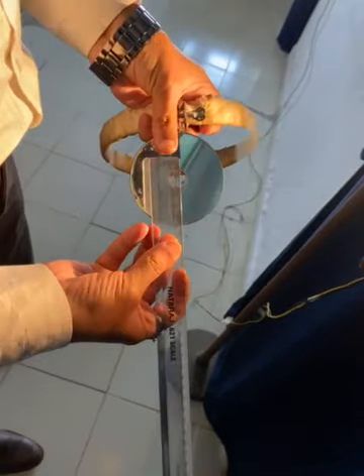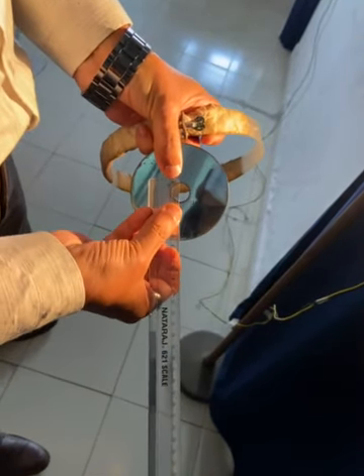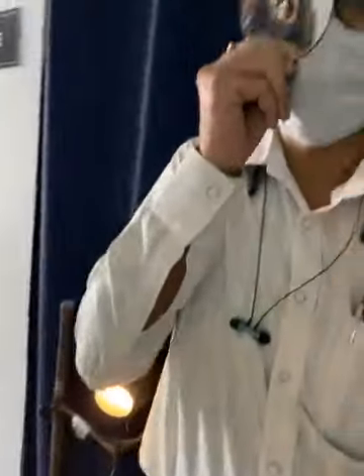Diameter of the hole is 2 centimeters, as we are demonstrating here. The hole has to lie in front of the right eye to visualize the structures to be examined. The right eye visualizes the structures, and the left eye helps us to see the stereopsis — the depth of vision, binocular vision.